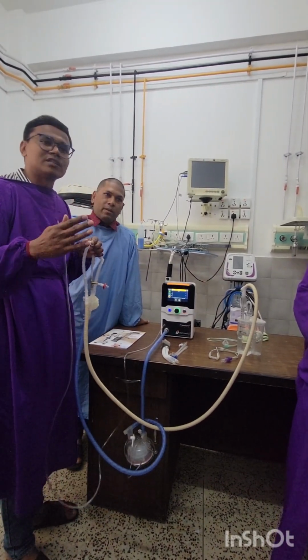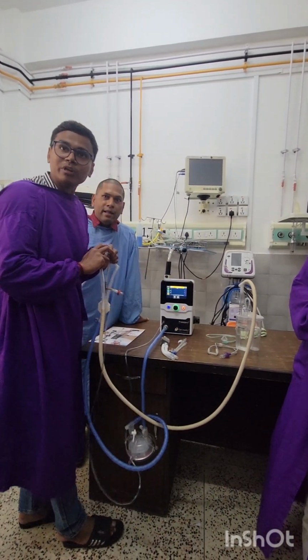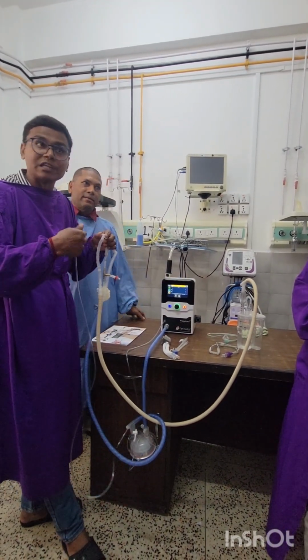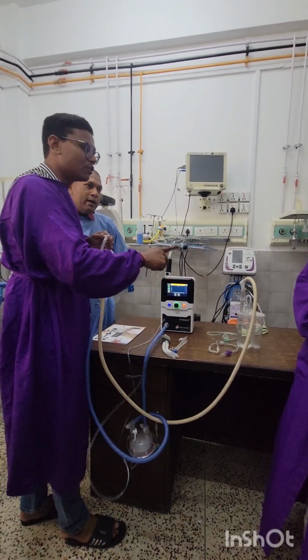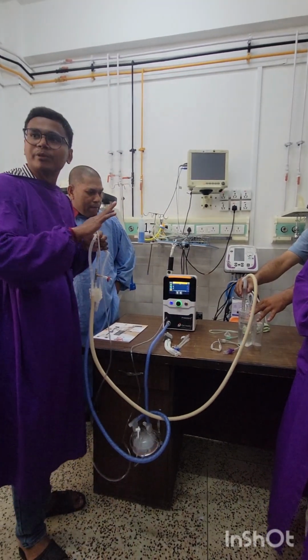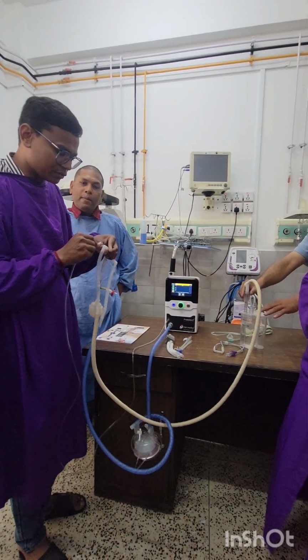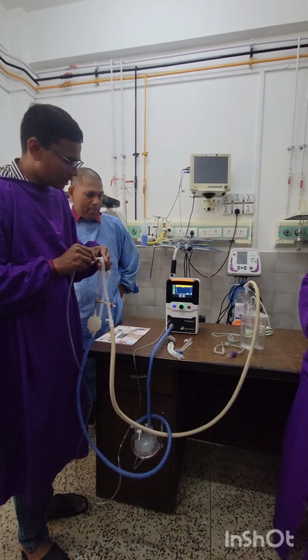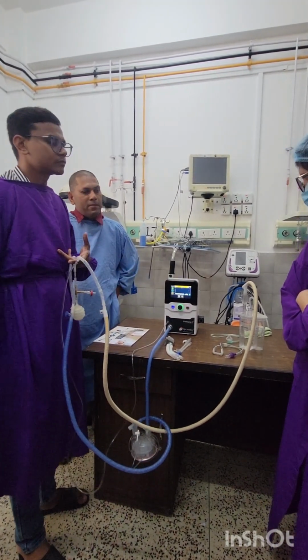So many factors affect your delivery pressure: the water level of this bubble jar, the leakage in the circuit, the leakage in the interface, everything is affecting it. You have only one indication while using a bubble CPAP: if the bubbles are going on, then your CPAP pressure is delivering. Here, with the help of this real-time pressure monitoring system, when I attach this monitor, you can see how much pressure is being delivered to the baby.